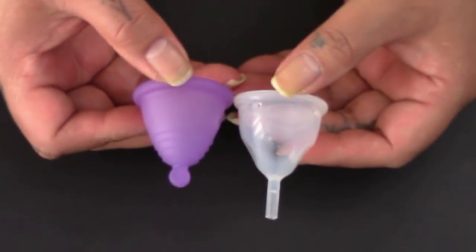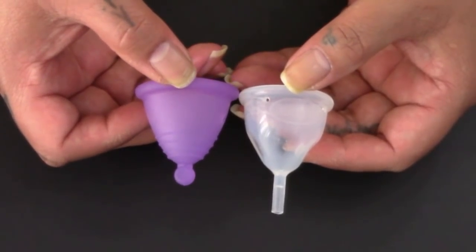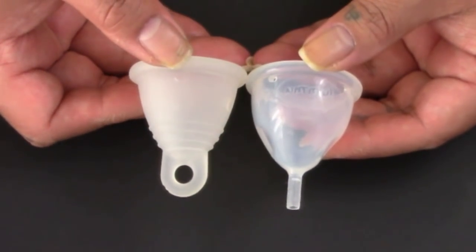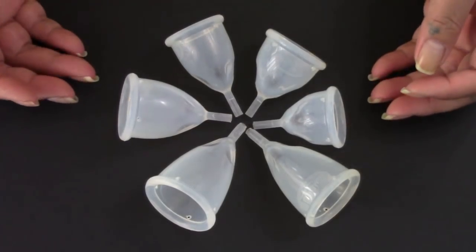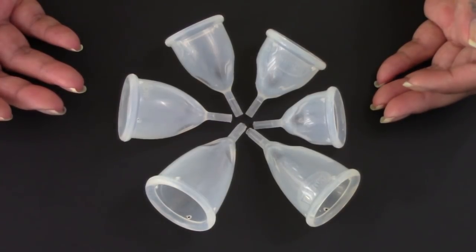The shortest Luma cup low cervix is about the same size as the Maluna Shorty, also in a size small. The Luma low cervix in the larger size is about the same size as the medium Maluna Shorty. If you're looking for a silicone version of the small or medium Maluna Shorty, these might be a great option. The silicone on the Luma cups reminds me of the Yuyuki cup, and a couple of them actually feel almost as firm as the Yuyuki Classic or the Yuyuki Soft.